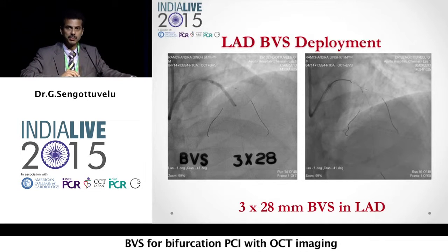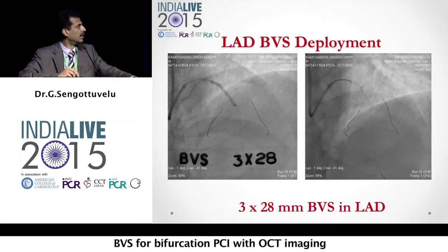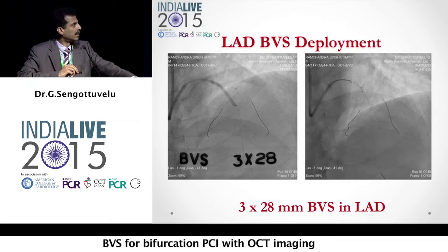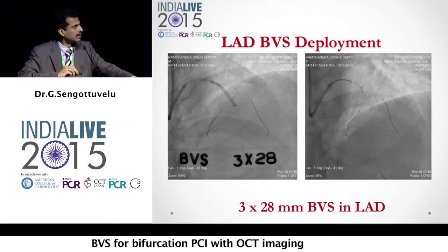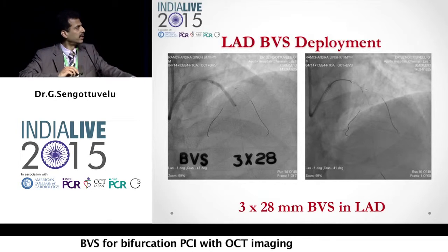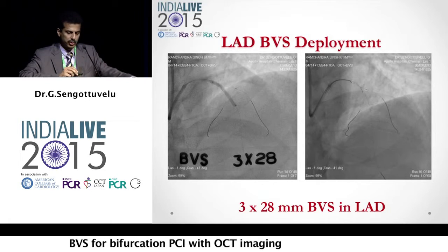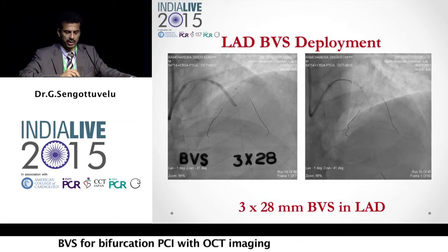The patient started having chest pain and a little hypotension. So we had to rewire through the struts of the absorb, and we used a 2-millimeter balloon to open up through these struts.